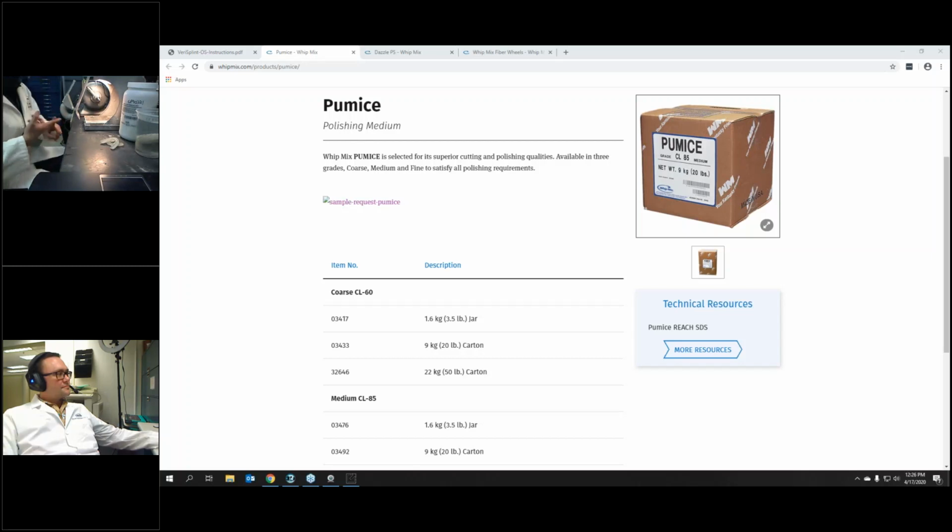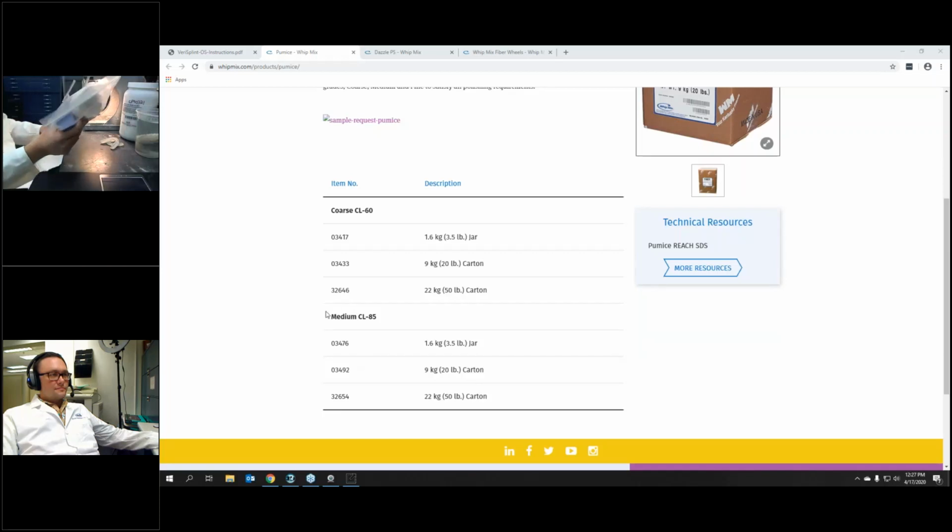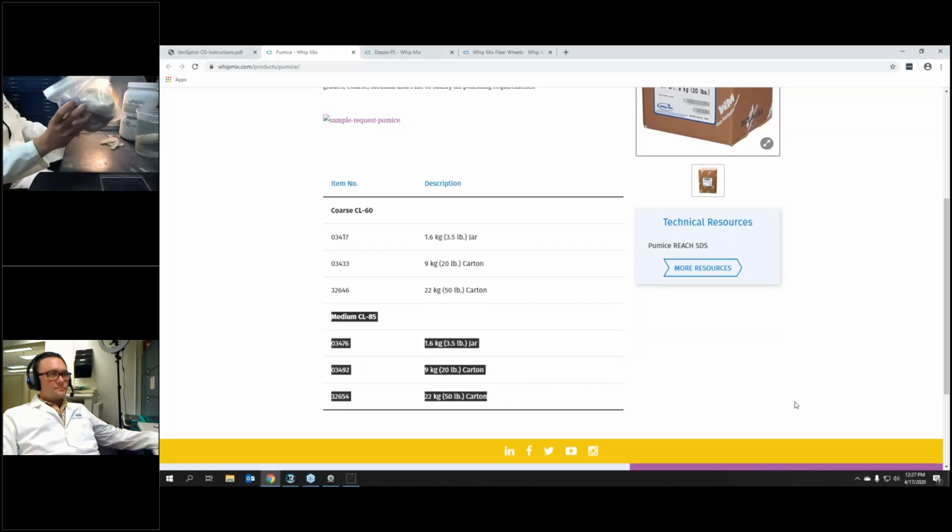So we're gonna start with a wet lathe with pumice. Once again, Evan already pointed out what pumice we're using. This is the medium grit, and then we do have some dry rag wheels that we will switch over to. And then we have an acrylic finishing compound. I would love to say I know what it is. It's been at Whip Mix forever. That's where me and Evan were like, we really need to find exactly what we're using. So if anybody's out there using an acrylic or maybe even a PMMA polish that comes in a rectangular purple brick, let us know what it is, because that's what we're using today.